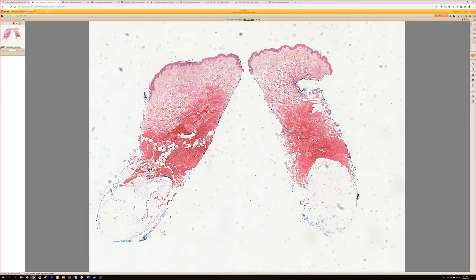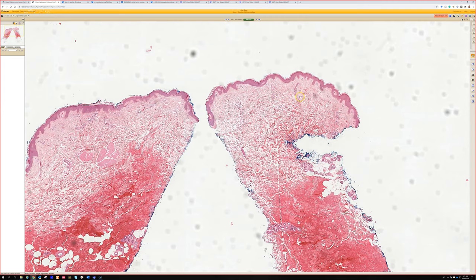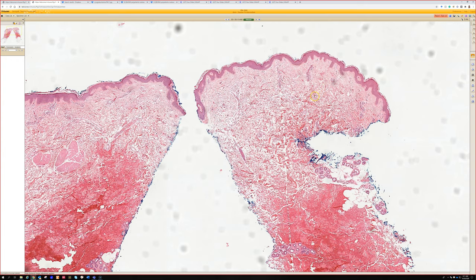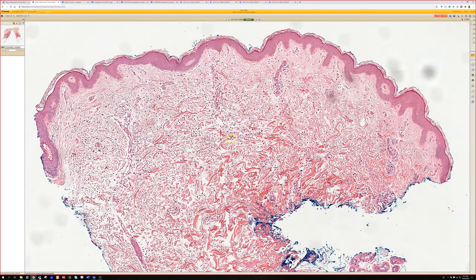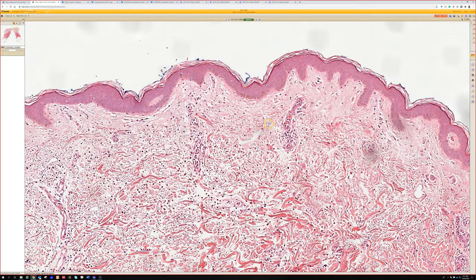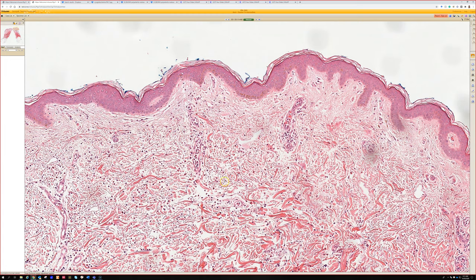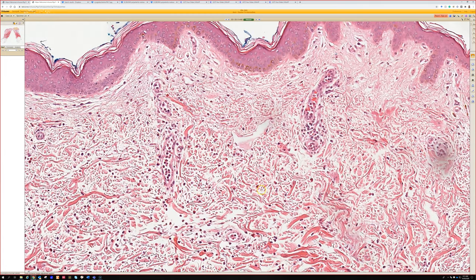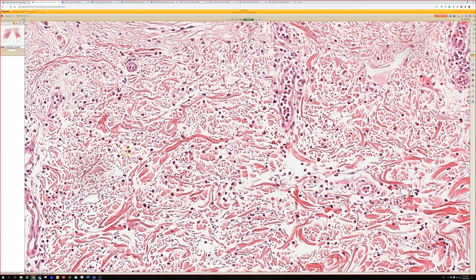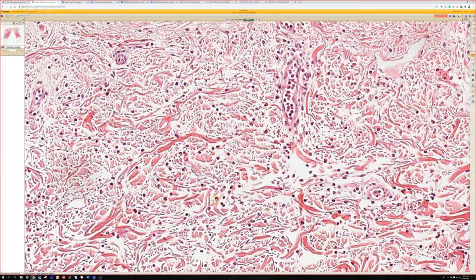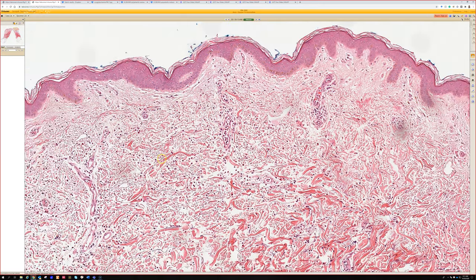Case 11. From low power it looked pretty normal. One thing that did catch my eye is that there's some separation of the collagen in the dermis. The collagen has got a lot of white space between it — could be artifact, but this seems pretty prominent. So there's probably a lot of edema in here. The blood vessels look dilated and there's some neutrophils filling them and around the area directly around them.